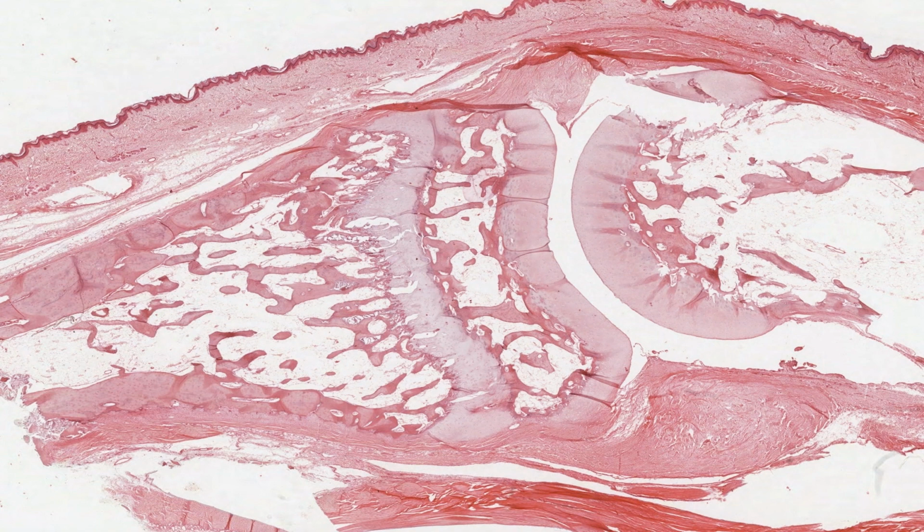Let me first describe a diarthrotic joint. This is a section of the finger joint. You can see one articular surface of hyaline cartilage here and the other here. This section shows later stages of chondrogenic formation of an endochondral bone. It also shows the histological structure of a diarthrotic joint or freely movable joint, often called a synovial joint. And it also shows a variety of connective tissues. Let's begin with the first of these.